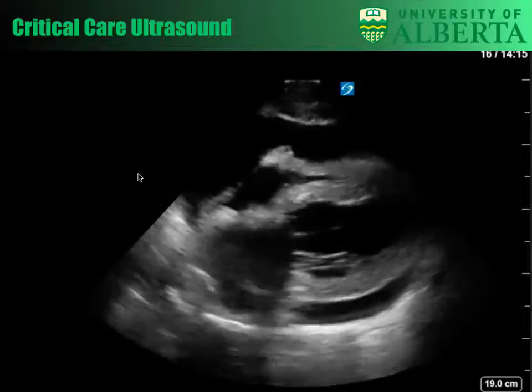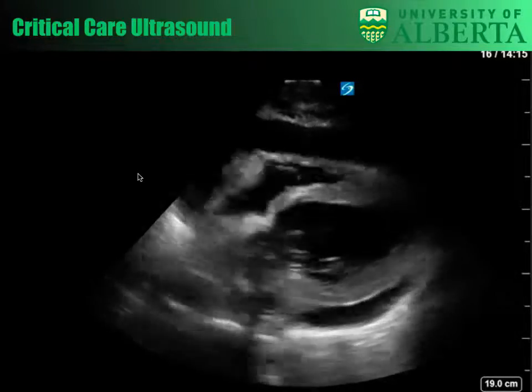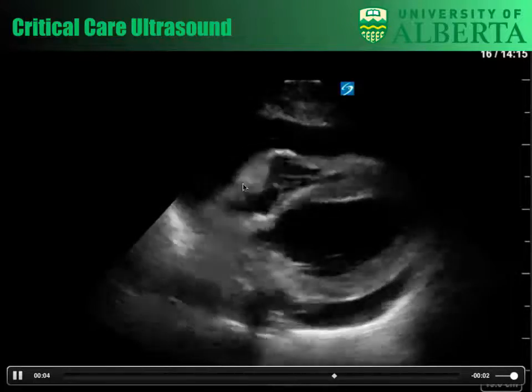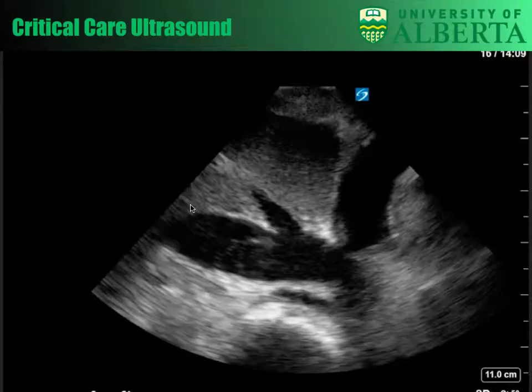Okay, and so here's our subcostal four chamber view. Again, we can further see that there is some collapse of the right atrium, and not much filling of the RV in that large anechoic space. We can see the left ventricle, right atrium, left atrium, and so not much filling of the RV cavity, again more of those features.